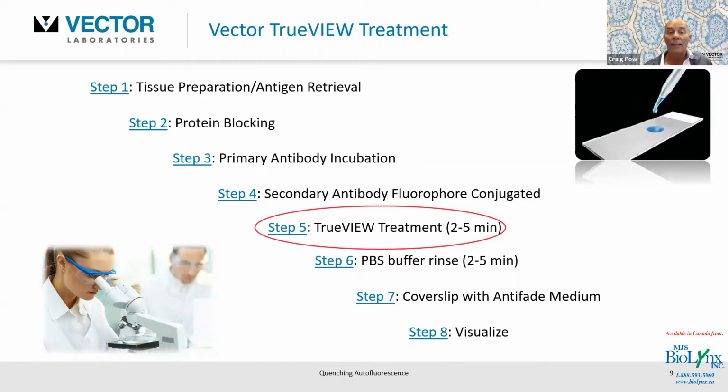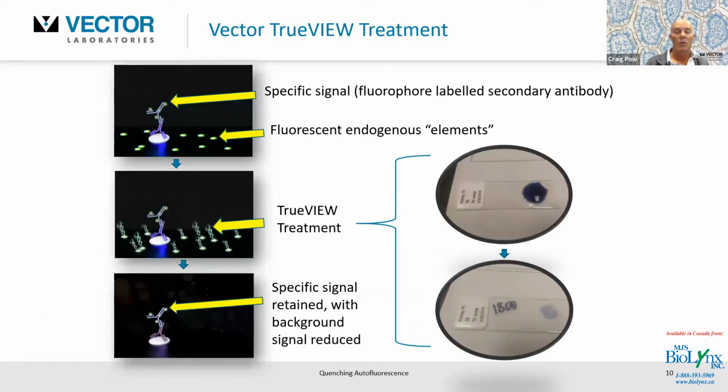Then you put on the TrueView at this step after you've applied your fluorophore for that short period of time, give it that brief rinse, cover slip, and then visualize. So the idea of this slide is to show you there's no great optimization required. You simply slip the TrueView in after you've done all the upstream detection, and then you do the cover slip. This is a bit of a schematic showing you what I'm referring to. Here would be your target antigen, that white dot, detected with a primary antibody, and then subsequently with this fluorophore conjugated secondary antibody. And you may be experiencing this endogenous autofluorescence.